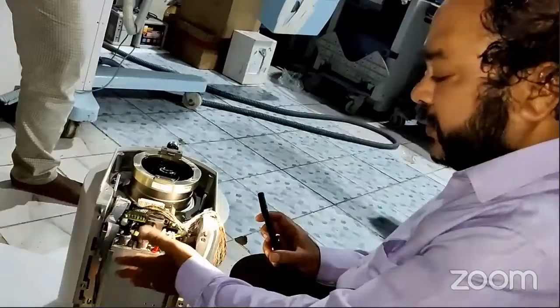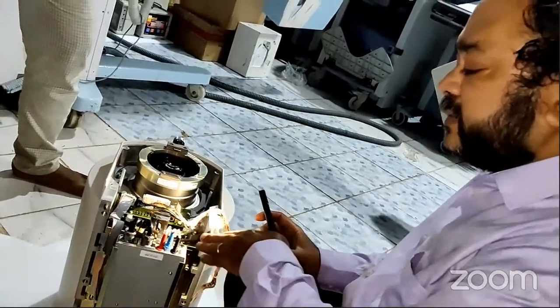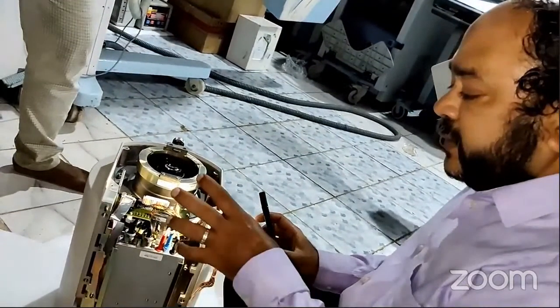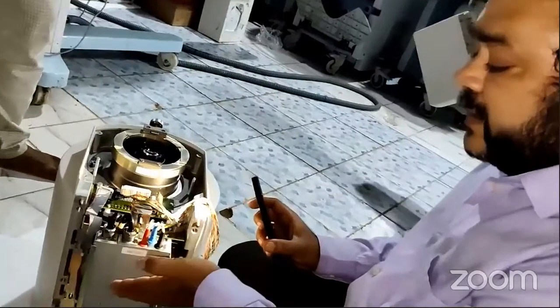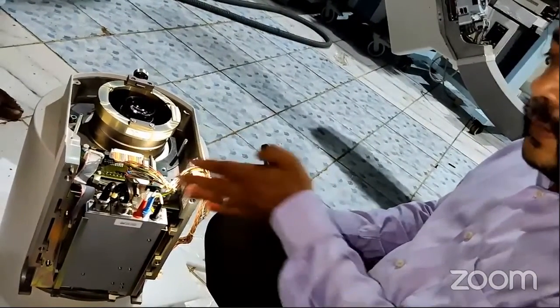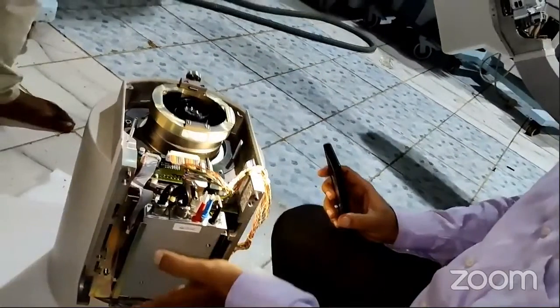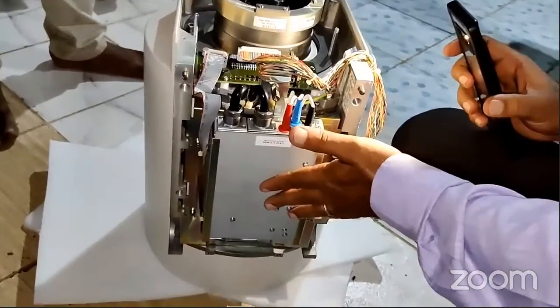Okay, and also the board is very costly, and you can remove the power supply, but you cannot repair it, because this power supply was completely isolated with some kind of special material, because it's a high voltage, so there should not be arcing to other boards or to the tube or something. Okay, so that's the reason the power supply was kept inside the tube.